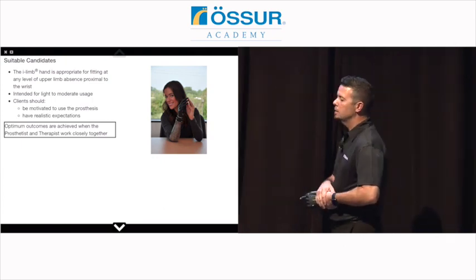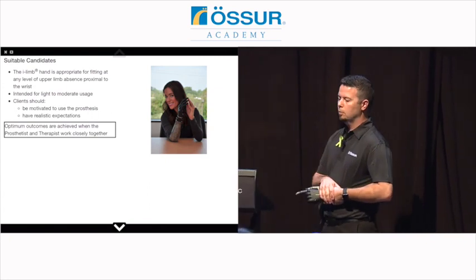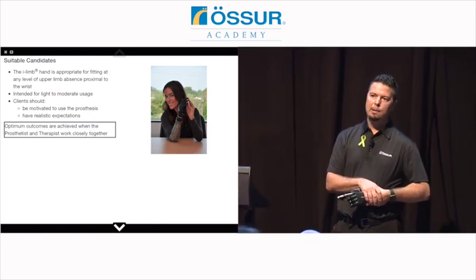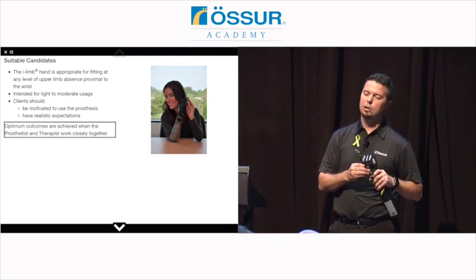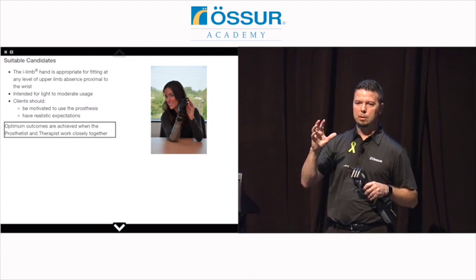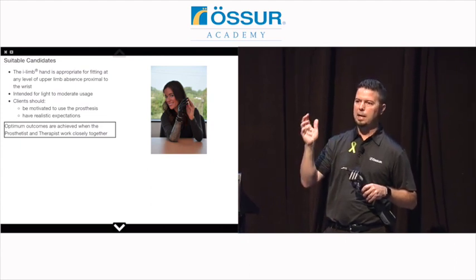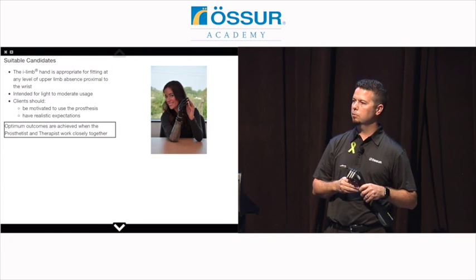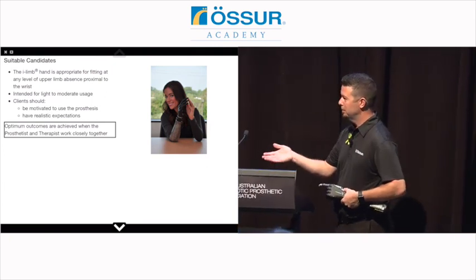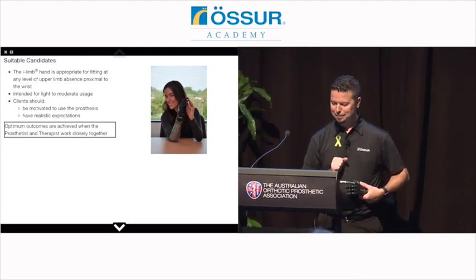It is intended for light to moderate usage. This is not for underwater welding or swinging a sledgehammer or anything heavy duty like that. The thing that makes multi-articulating technology great is that we have a lot of dexterity, but that also can make it susceptible to high impact and high torque forces that you want to try to avoid. It's obvious that you can still fly a plane with one, but yeah.